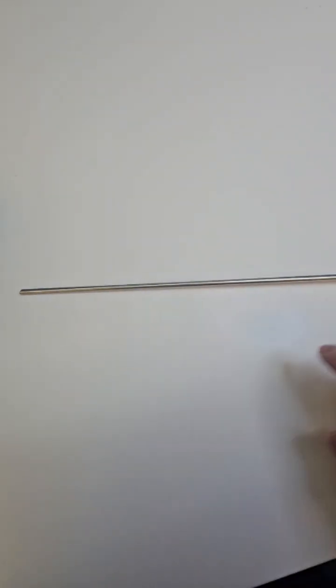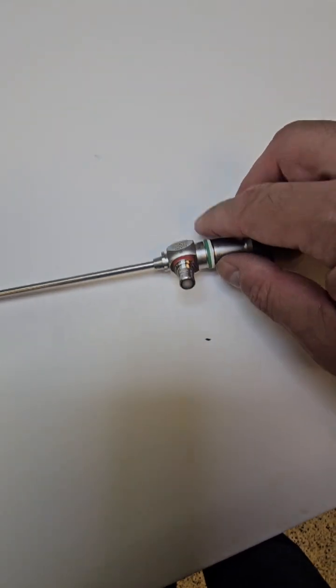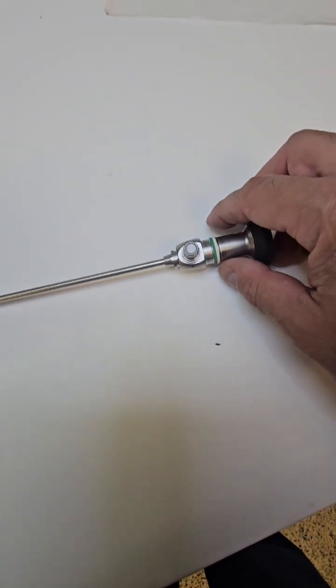First and foremost, you want to inspect the outside. Of course, you're going to inspect for cleanliness, but we're going to inspect for damages on the shaft.